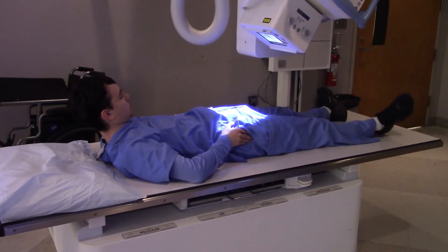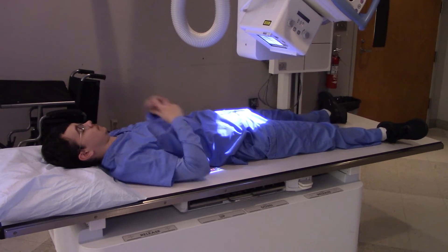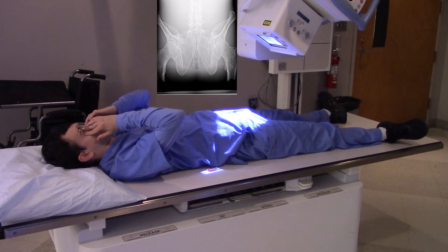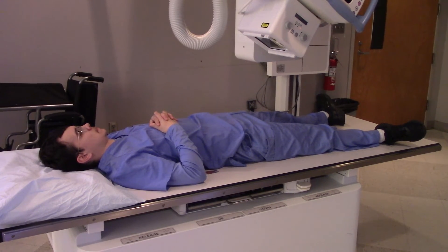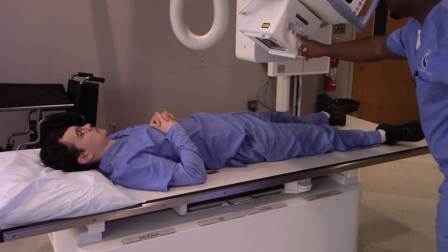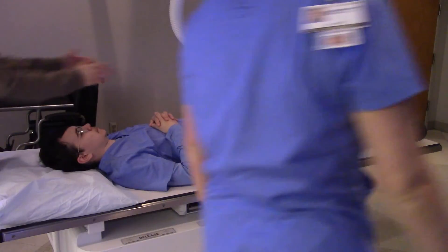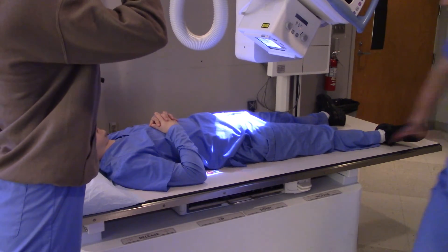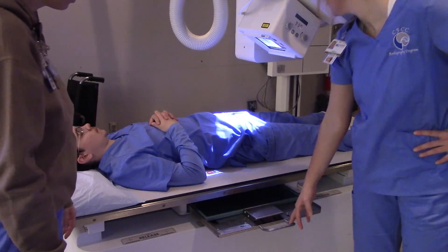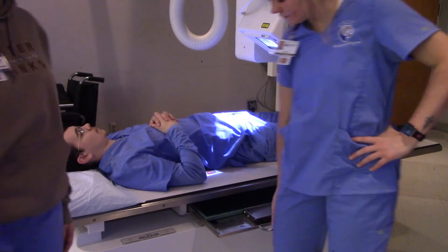Can we shield this patient's gonads? The answer is no, because we're right below the pubic symphysis. If we put a shield on there, we're liable to mess up our image and have to repeat it. So in this case, we're just going to go without the shielding. We're centered at mid-sagittal, about one inch below the top of the pubic symphysis. We've got a marker on. Everything looks good. Let's do it.